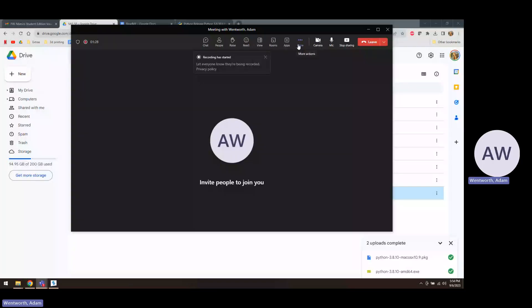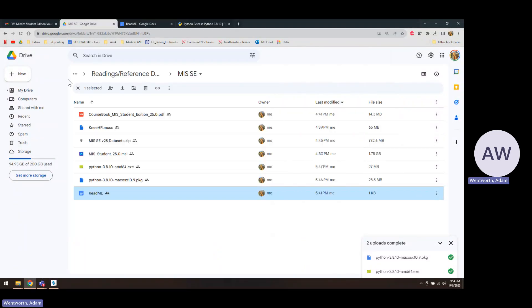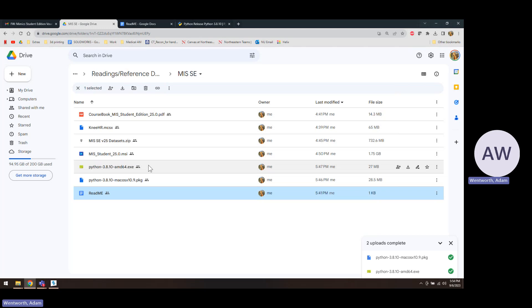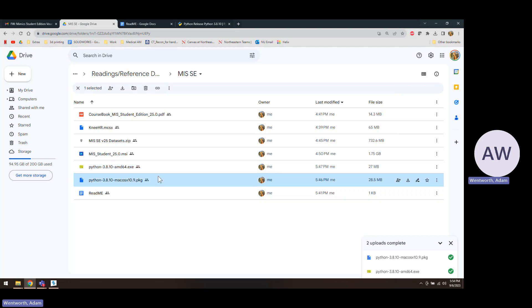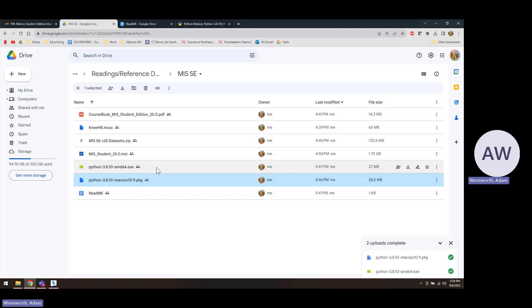Hey guys, this recording is to show people how to set up scripting with Mimics. The first step is to download Python. The latest version of Mimics uses Python 3.8, so we've got the Windows installer and a Mac installer that'll work for versions 10.9 and up. You go ahead and run the install and you can set it to the default folder or whatever that is.